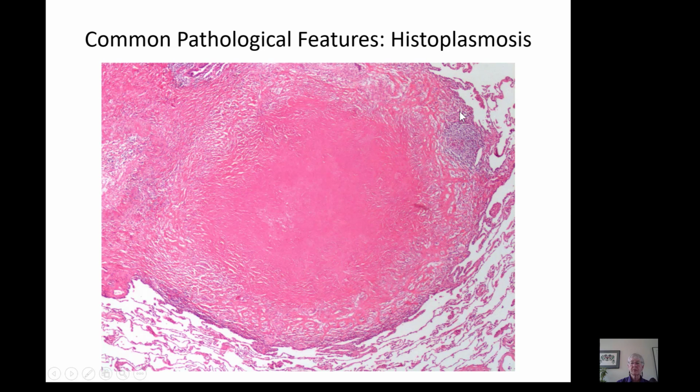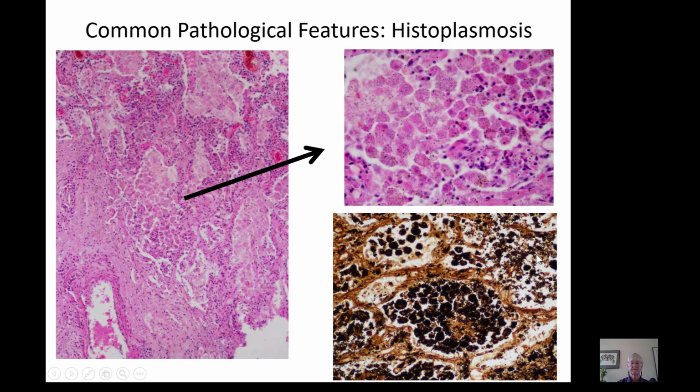This is histoplasma, and this is a histoplasmoma, where there is a dense fibroconnective tissue capsule which surrounds this area of necrosis. And if you stain this with a silver stain, you could find little collections of remnant histoplasma organisms. Histoplasmosis does not necessarily form granulomata.